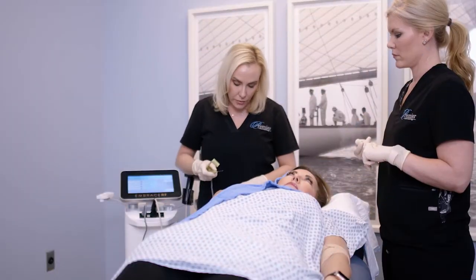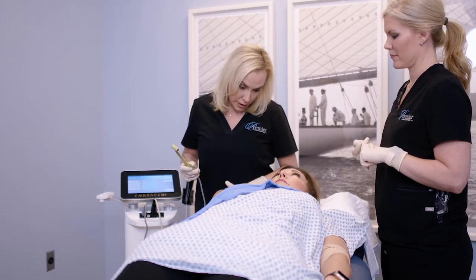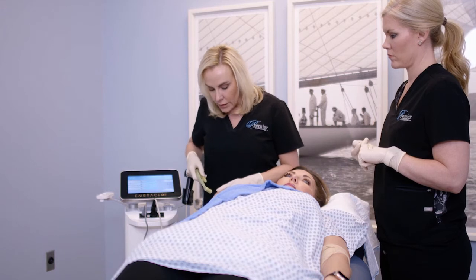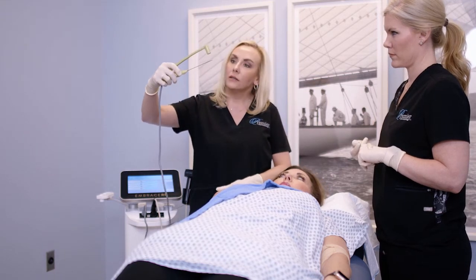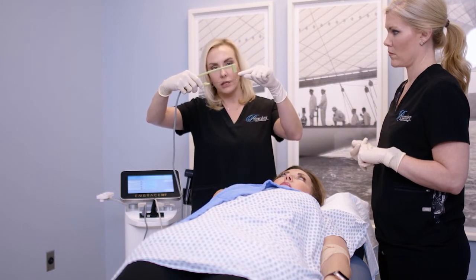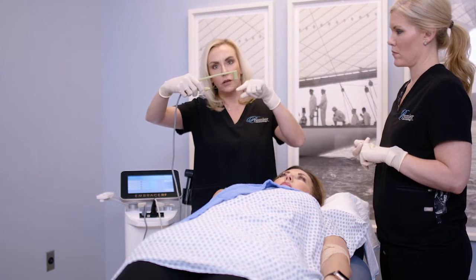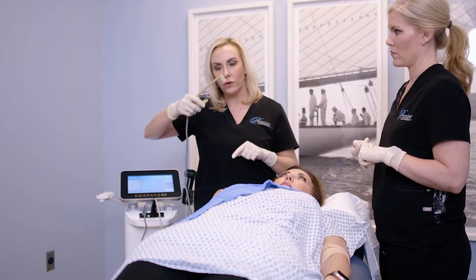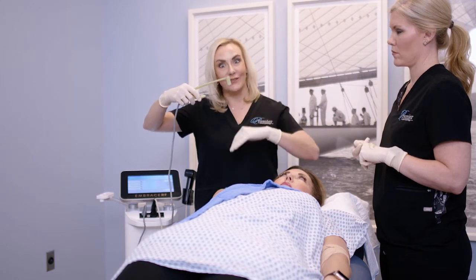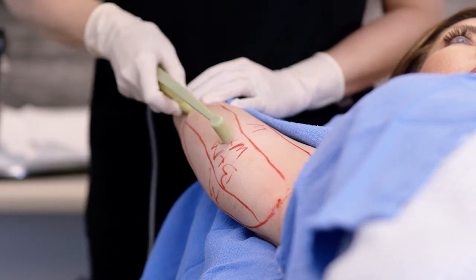All right, Miss Sherry, we are going to actually go ahead with the treatment. If you have any discomfort at all at any time, you just let me know. Okay, sweetie? You're just going to mostly feel some pressure here. So this is the body tight handpiece. It's really neat because this shoots energy and communicates back and forth to this little tip of the cannula. So we'll be moving this back and forth underneath the skin to get uniform heating down deep and then also on the surface. So here we go. We're going to go right in here. Lots of pressure. How you doing?